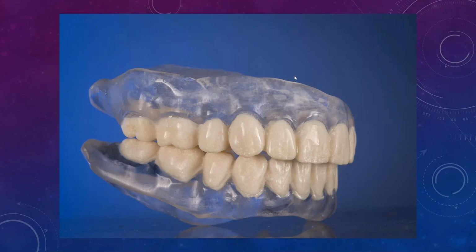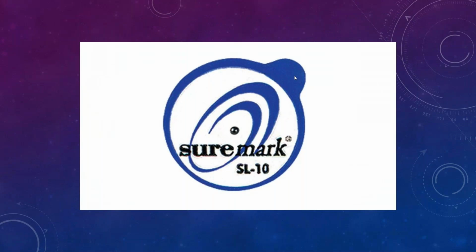I think I have a picture. Yeah, these SureMark stickers. That's what we've been using as of lately. Patient comes in and they have a really good denture and it fits well. We're just going to use the SureMark stickers to do that dual scan protocol.